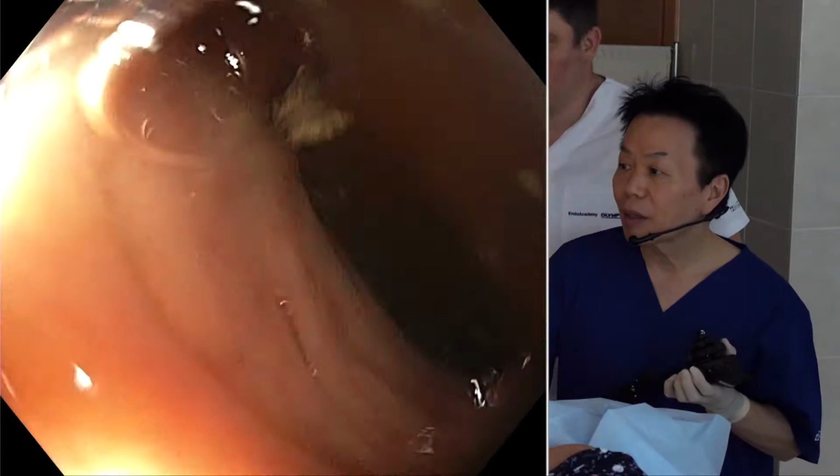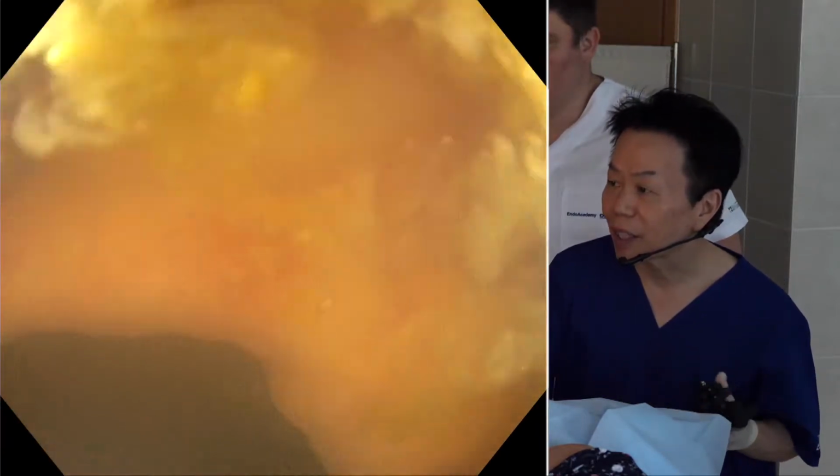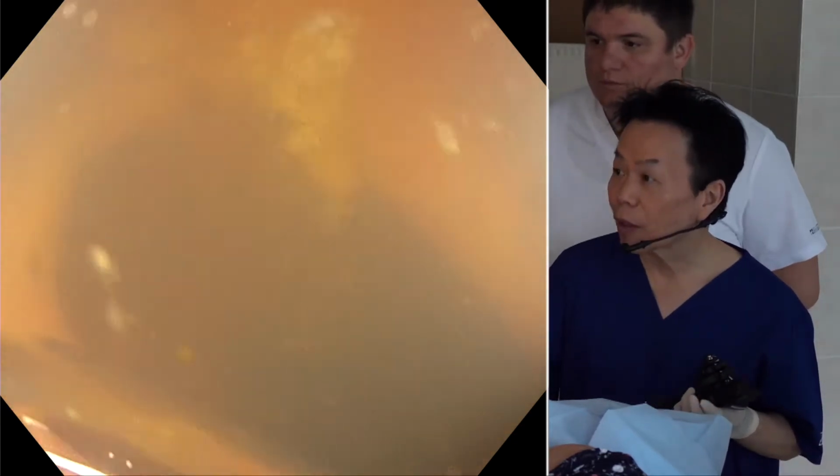I think now the tip of the scope is near the splenic flexure, and I feel that the sigmoid colon is a little bit elongated, but I'm trying to shorten the colon as much as possible. Can you see my right hand? I'm pulling back the scope as much as possible.